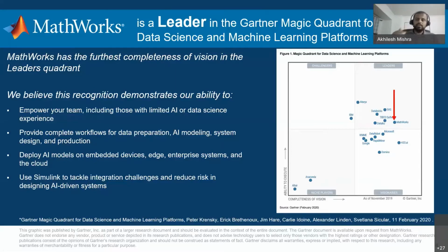And today we will see why rightly so it is justified, because Mathworks is not only focused on developing just the AI model, but actually it is focused on tools that help you solve your biomedical problem and let you develop a medical device or a medical algorithm all the way from end to end. So all the way from design, requirements, developing the algorithms, and also getting it validated and verified so that it can be certified with the certification authorities. We have the tools to be able to do that.